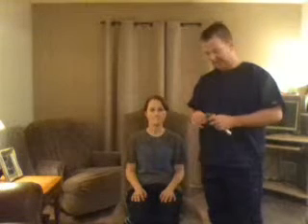I should be able to observe with the tympanic membrane the handle of the malleus, light reflex, the pars tensa, and the pars flaccida. If there is wax or other obstruction, those are, again, things to report, because there might be issues with infection or overproduction of wax. Another item that frequently is used during this time frame would be a tuning fork as well.